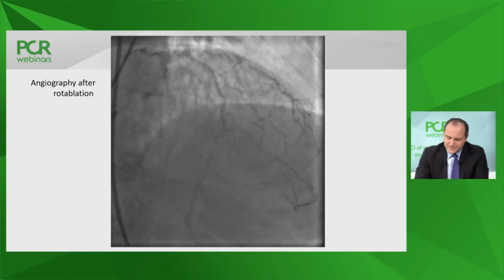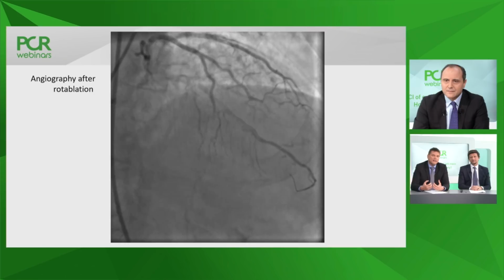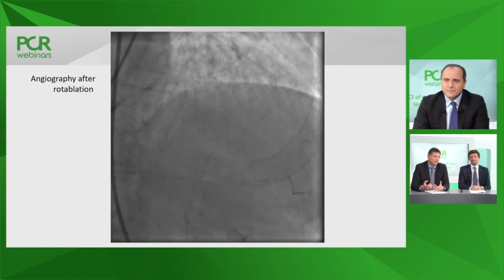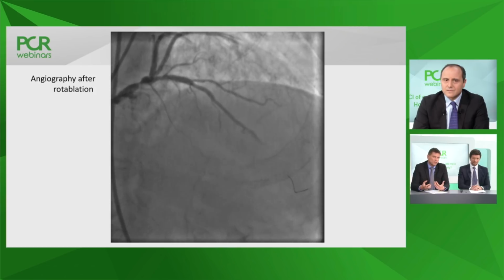And again, the question goes to you, Chris. Happy now with the result? Yeah, I'm happy. I mean, I see the flow even improved in the LAD. And again, I wouldn't take the angiographic result as the answer to the question if I should now upsize. I know the vessel size. I think a 2 millimeter bar is a little bit aggressive, so I would stick with 1.75.